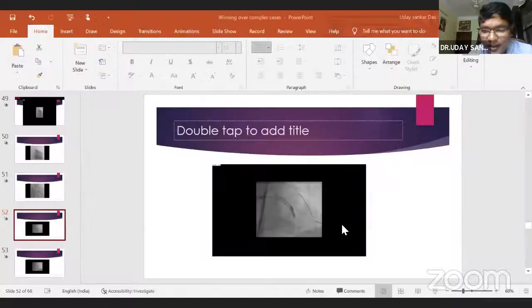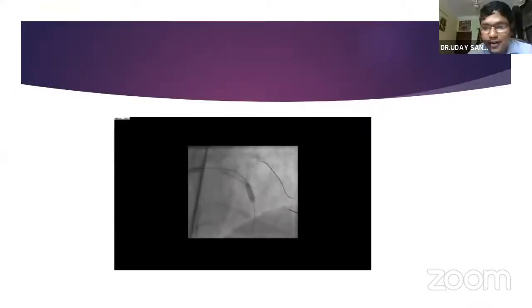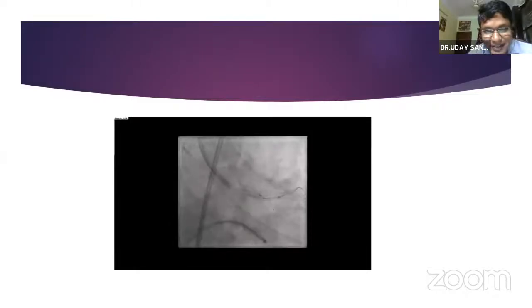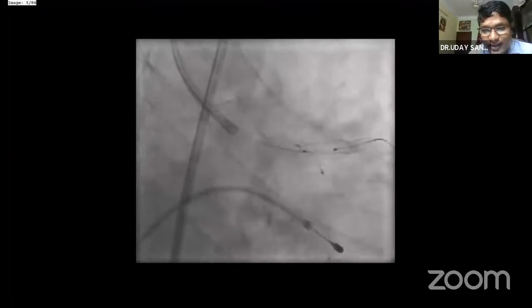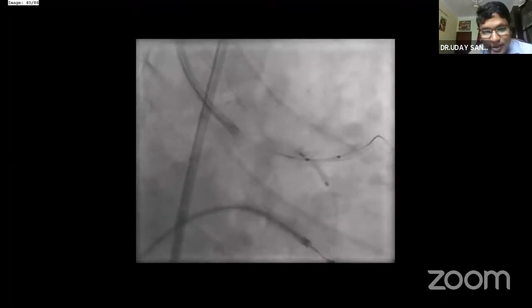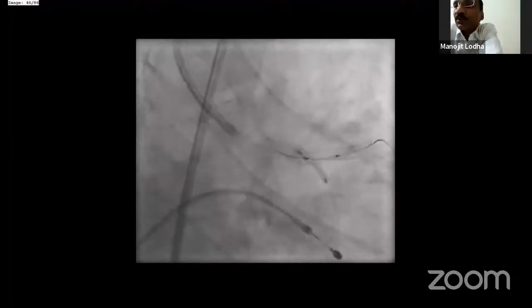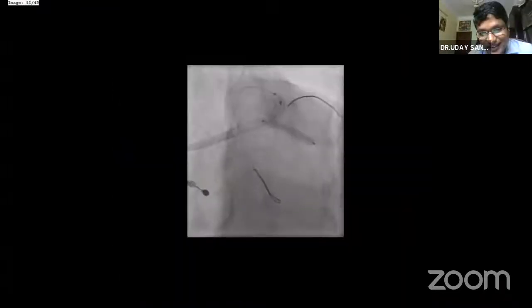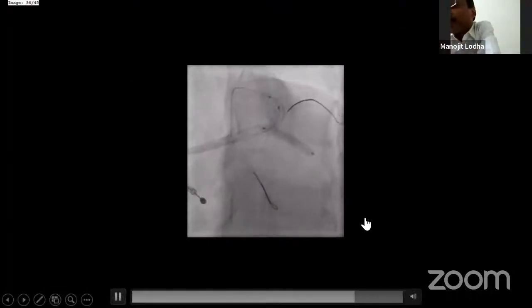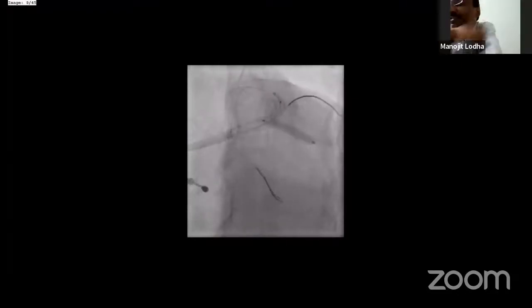I tried to do a TAP technique, but somehow the stent started more in the left main, so it becomes a culotte now. Perhaps it's a type of modified TAP or modified culotte, in between TAP and culotte, you can say that. But my target was to do a TAP because it's quite a wide angle, and there was a diameter mismatch between LAD and LCX. So it's not a culotte, because you have put both the balloons and dilated simultaneously. That's what I am saying: if the circumflex stent is a bit too much in the left main, you put a bit less. Sure.